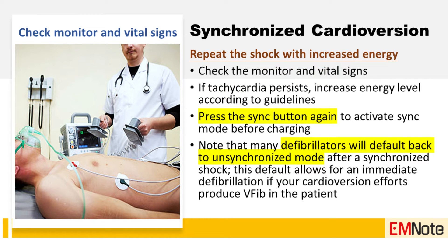Step six: repeat the shock with increased energy if needed. Check the monitor and vital signs. If tachycardia persists, increase the energy level according to ACLS guidelines. Press the sync button again to activate sync mode before charging, as many defibrillators will default back to unsynchronized mode after a synchronized shock. This default allows for immediate defibrillation if cardioversion efforts produce ventricular fibrillation.